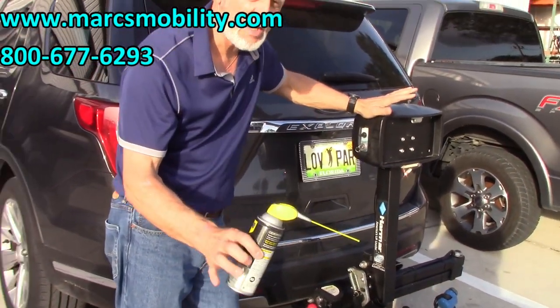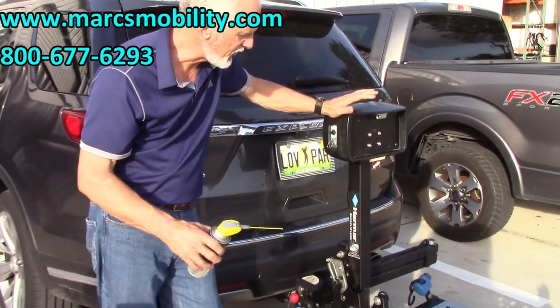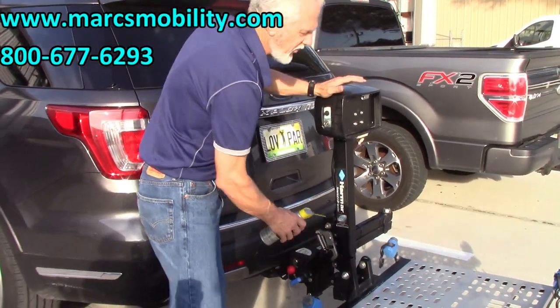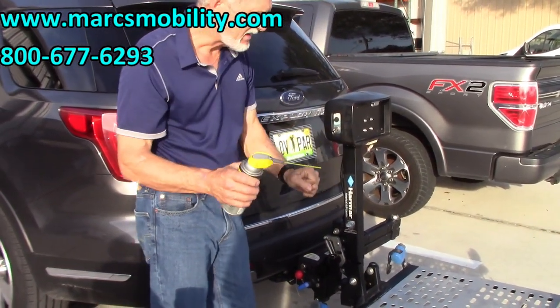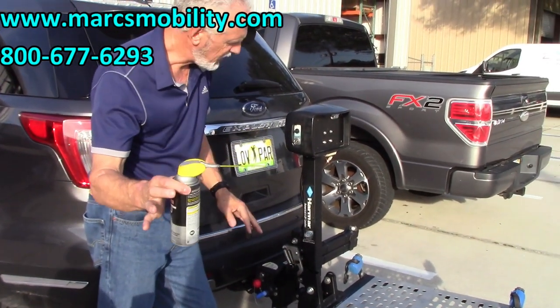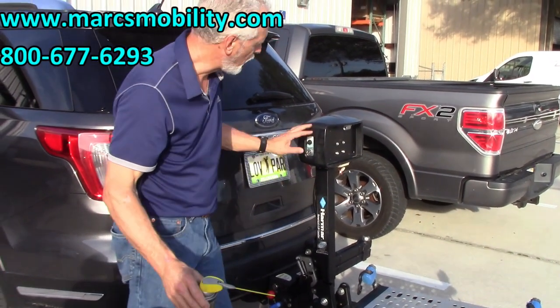Do not put lithium grease. Do not put any other type of grease. Just put WD-40 on there every time you leave the house so you have a smooth transition when the wheel goes across — so you don't have any snapping and don't bend anything. Keep the bar and the wheel clean, and you'll get 10 years of usage out of this lift with no problem.